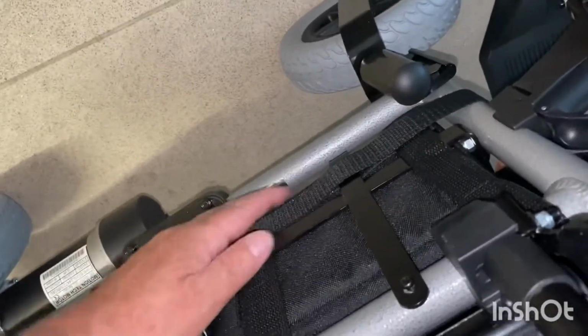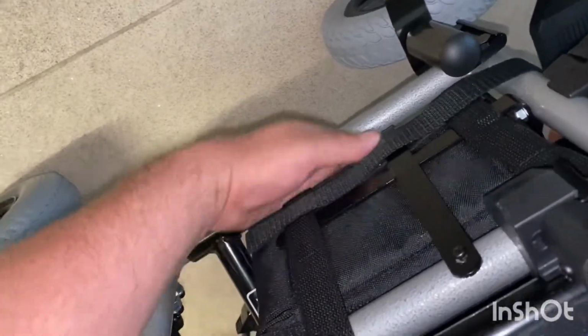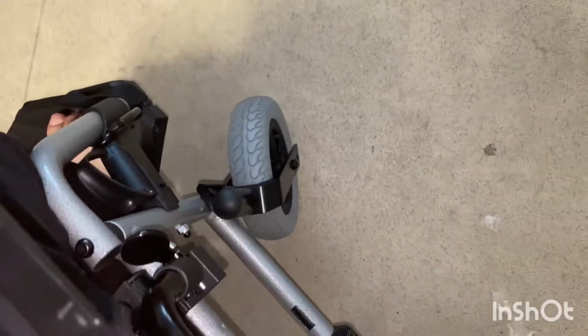Oh, that's the battery. It's small and very light. You can take off the battery and charge it on its own and then put it back in. Or you could just charge it where it is. So it's really easy to do. Also, I can get an extra battery. Next time, maybe.